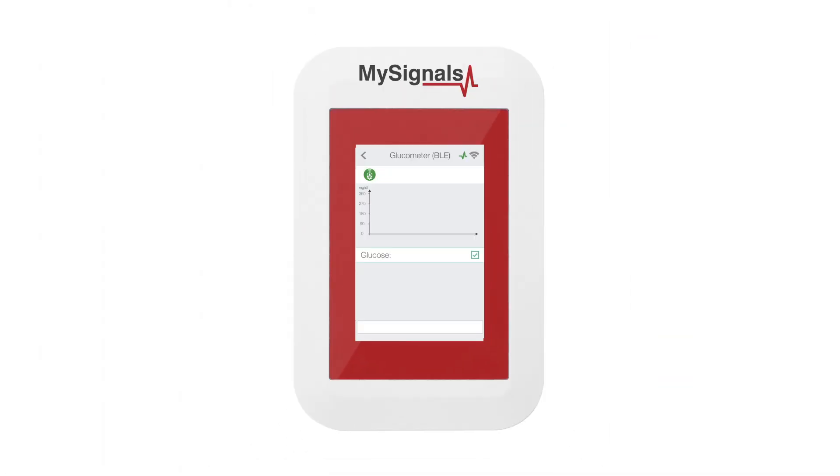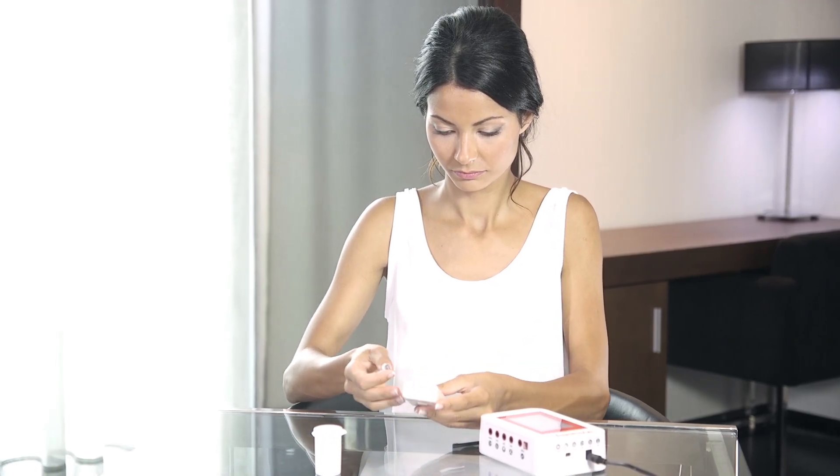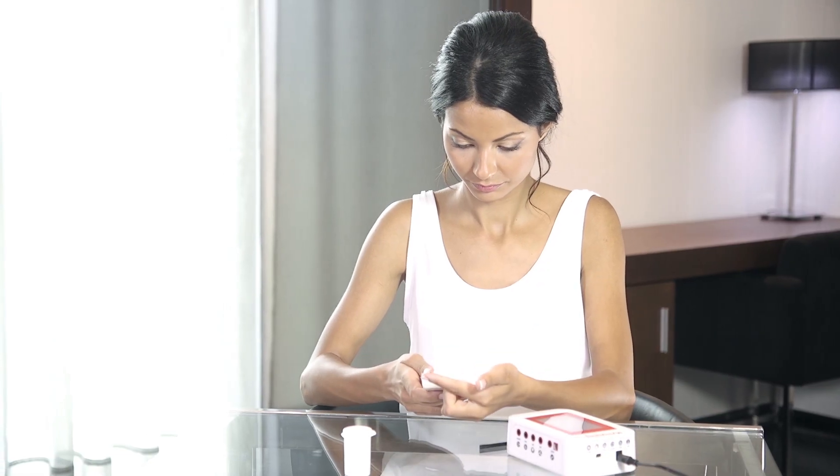Click on the sensor icon to start real-time data visualization. To power the Glucometer Bluetooth Low Energy Sensor, insert a strip in the sensor. You have one minute to make the measurement.